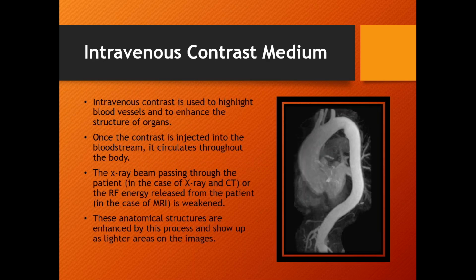Now the fluid, you can see here, this is an image of the heart, all right? And you see the heart in the background, and then this large, very well lit up artery right here. It's called the aorta. Intravenous contrast is used to highlight the blood vessels, as we can see here. Once it's injected, it circulates throughout the patient's body.